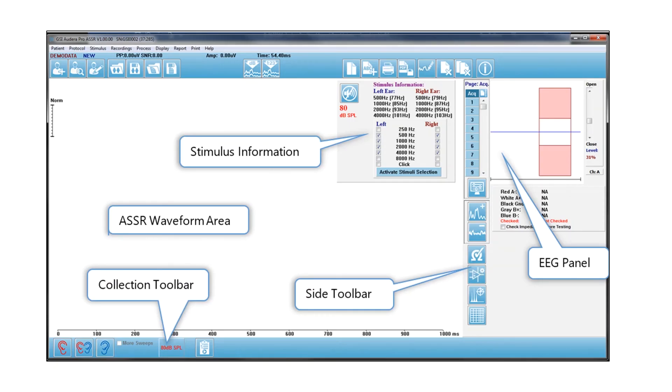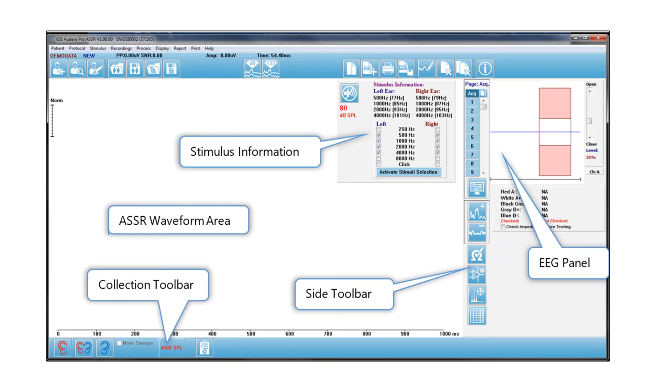When we go into the Adera Pro screen, this is what you see. We call it the acquisition screen, so you're ready to test immediately. The white area in the middle is the ASSR waveform area. You don't really analyze those waveforms in any way, but they will appear on the screen.